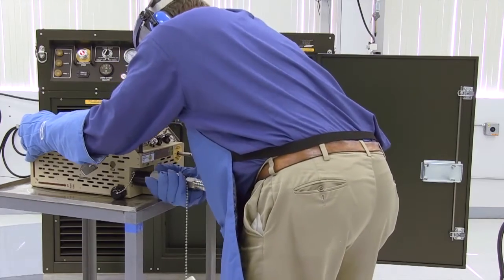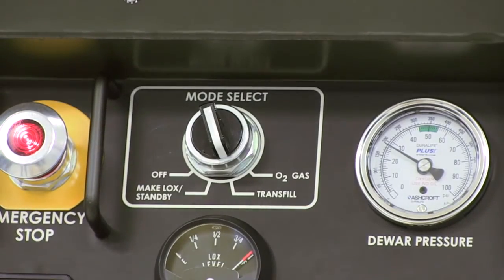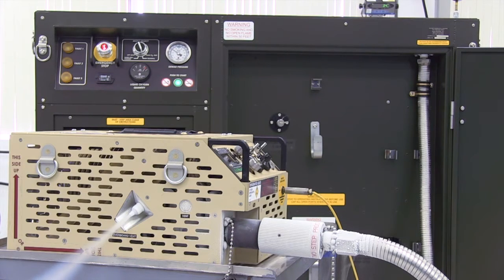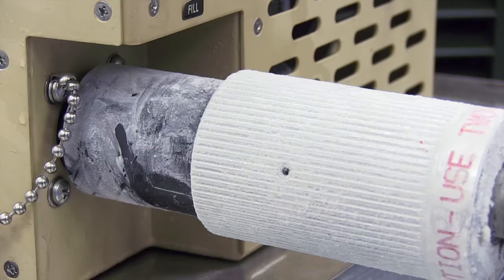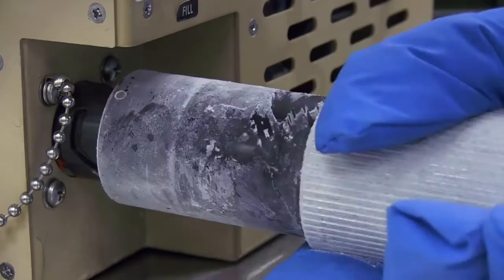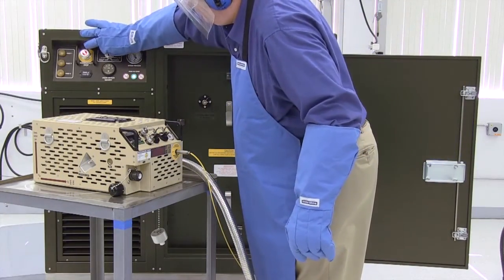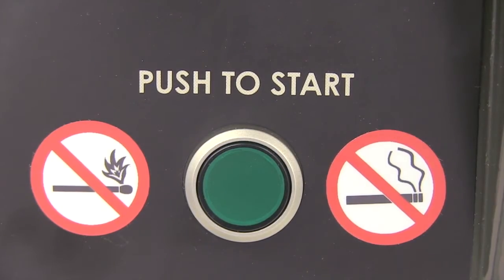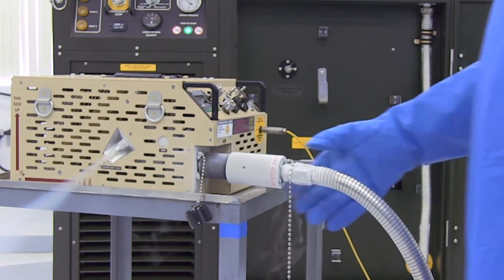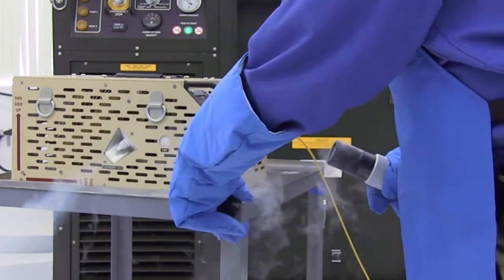Connect the liquid oxygen transfer hose to the LOX vessel to be filled. Turn the mode selector switch on the control panel to transfill. Press and release the green push-to-start button. When LOX transfer is complete and the secondary item is full, remove the liquid oxygen transfer hose and let the filler valve defrost before replacing the protective cap. Turn the mode selector switch to make LOX standby and press the green push-to-start button to restart the system. It is important to note that some LOX is lost during transfer; typically, 25 liters would be required to fill a 20-liter device.